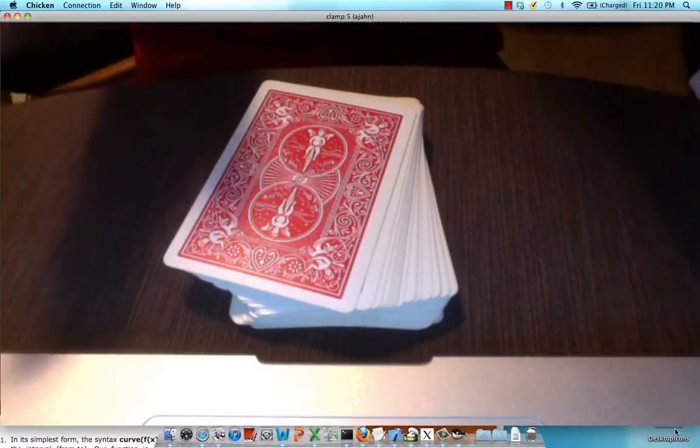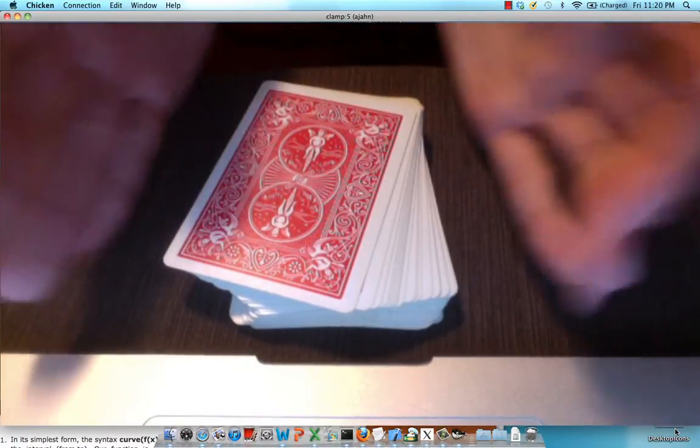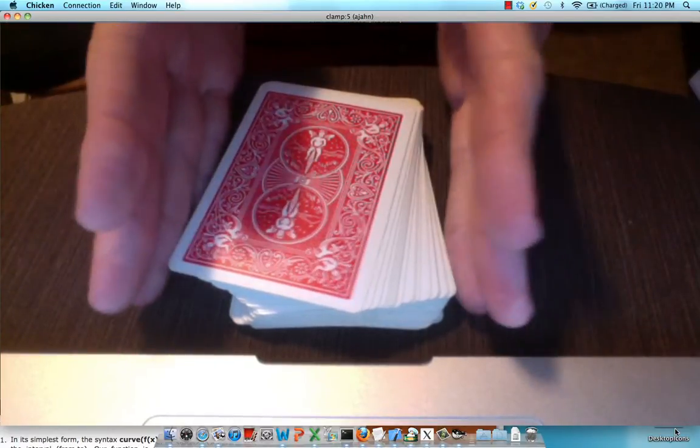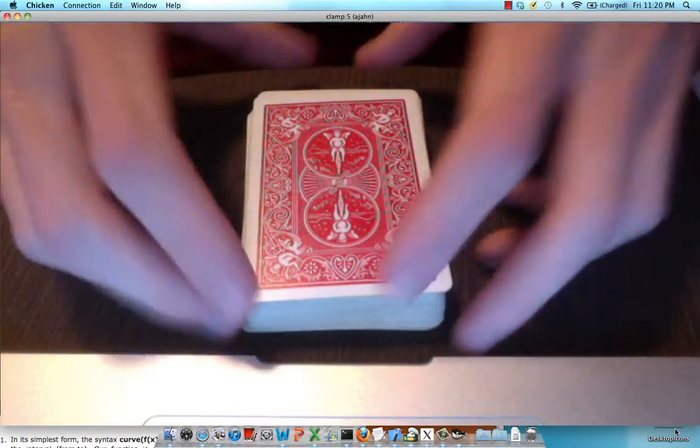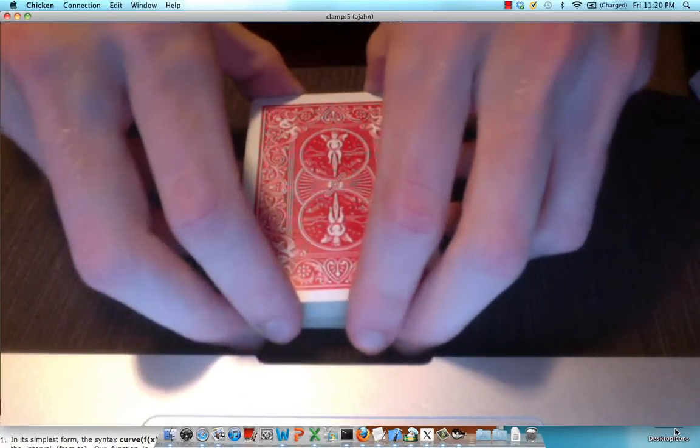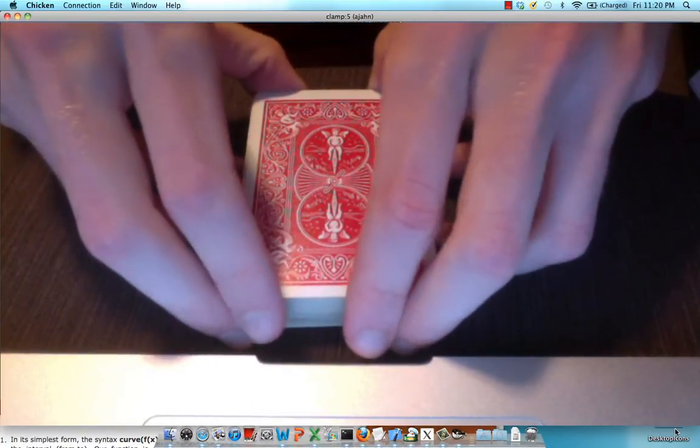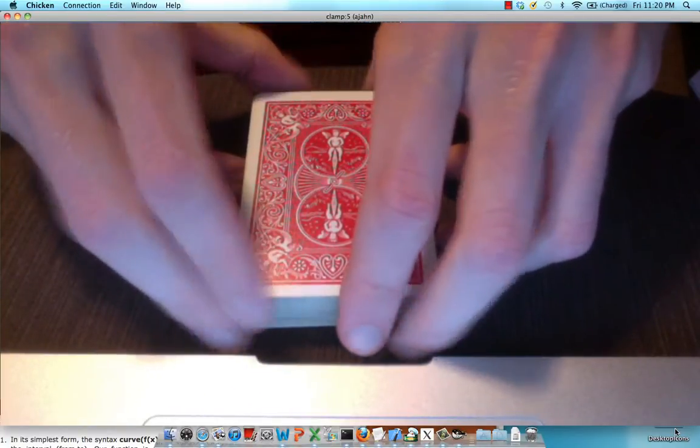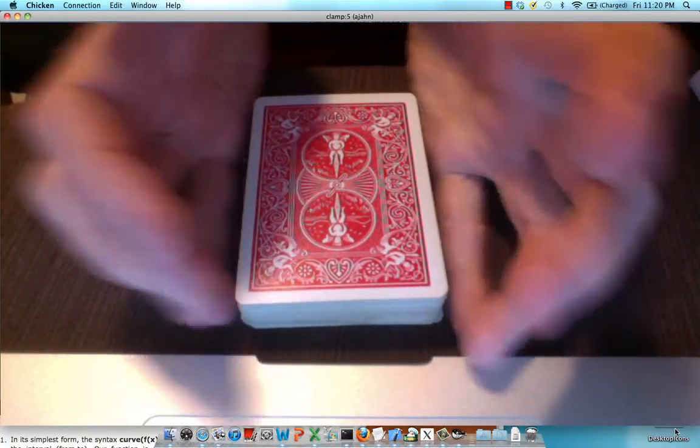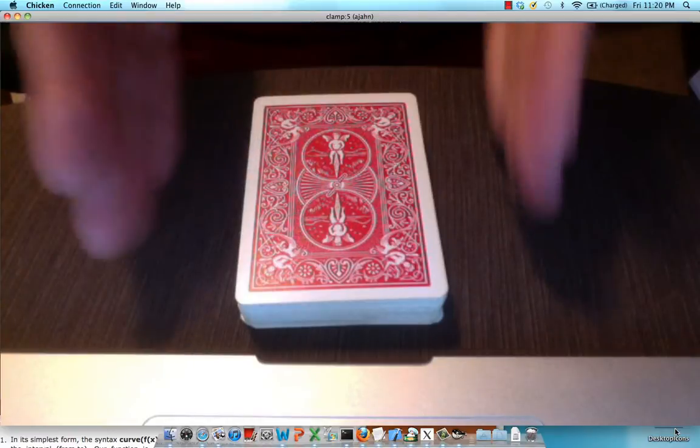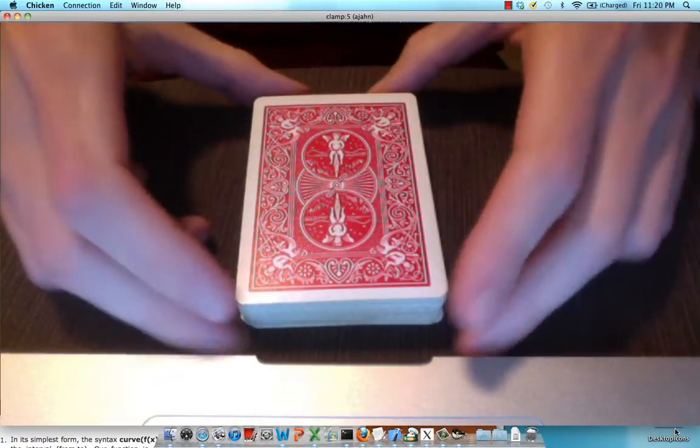What realignment and motion correction does is it aligns all of these to be in roughly the same orientation, just like you would straighten out a deck of cards to make them look nice and straight.